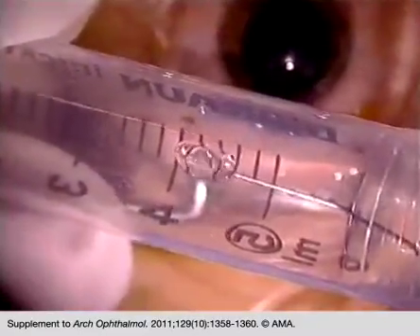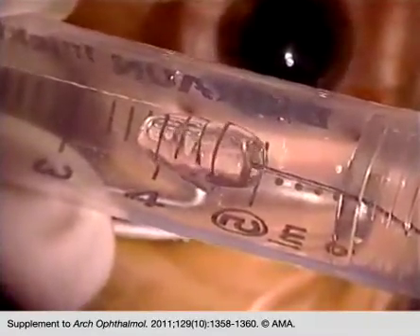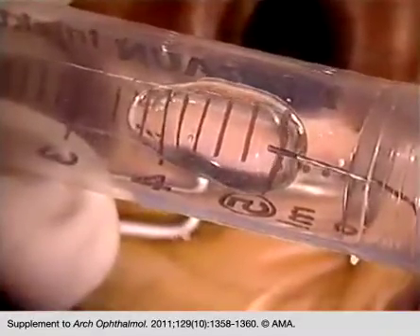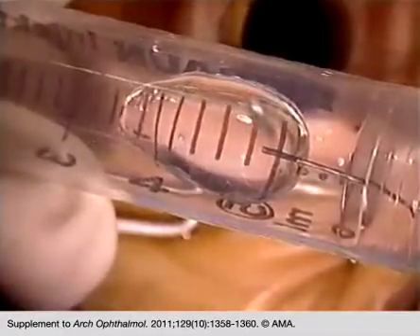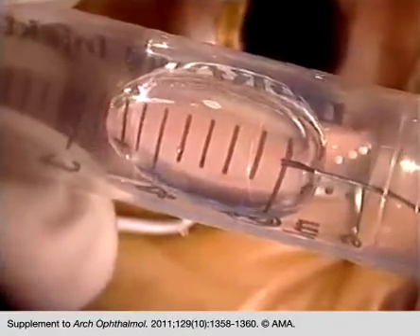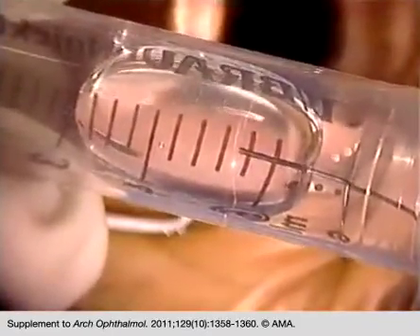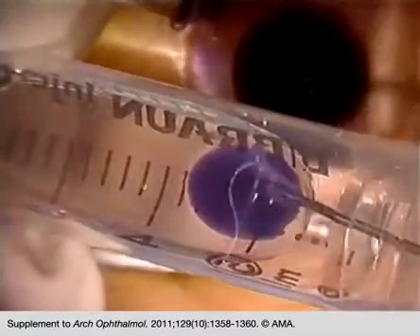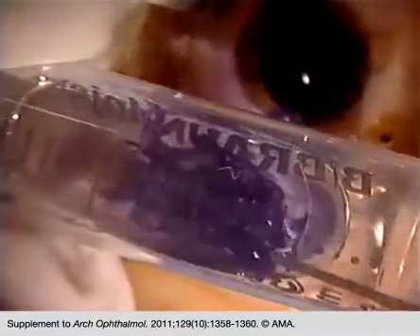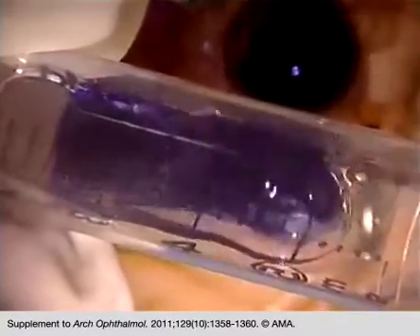For better visualization in such cases, we perform viscosurgery with vital staining. We mix 1 cc of 10 mg per ml sodium hyaluronate with 0.1 cc of trypan blue within a 5 cc syringe. The mixture must be as homogeneous as possible and without bubble formation.